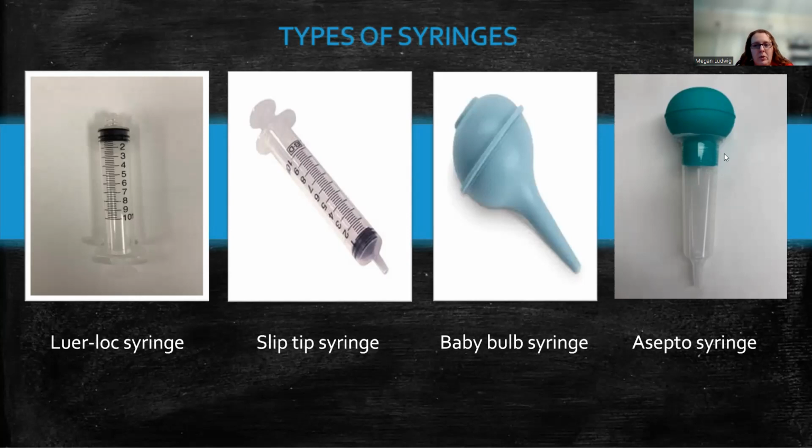So if they give it back to you and it's probably just the bulb that is full and nothing else, you would write down 60 mLs and refill it. You have to keep track of how much fluid you've used in the case so they can keep track of blood loss. In that suction canister, you can't differentiate between how much blood is in there versus how much irrigation you may have used. So you have to do a little bit of math to figure out how much blood is in there versus what you irrigated with.